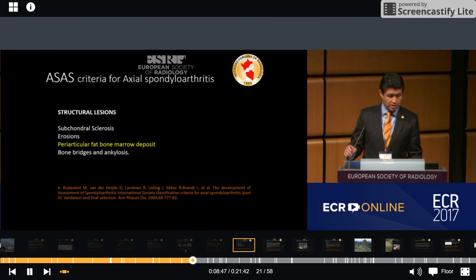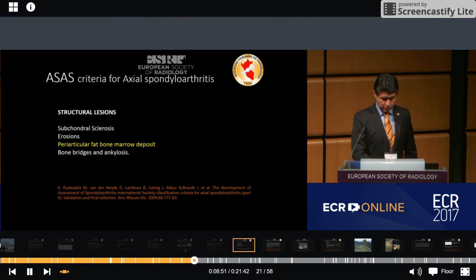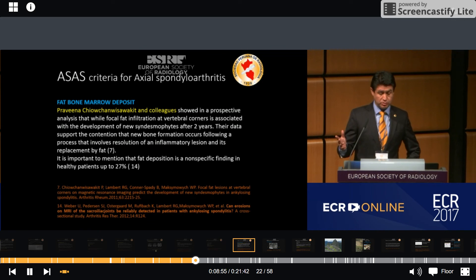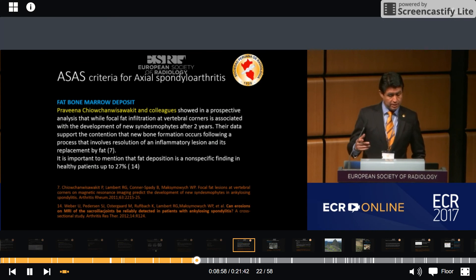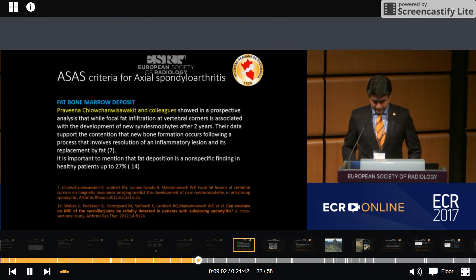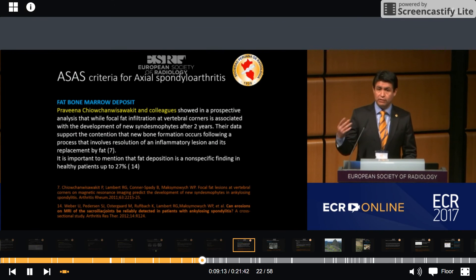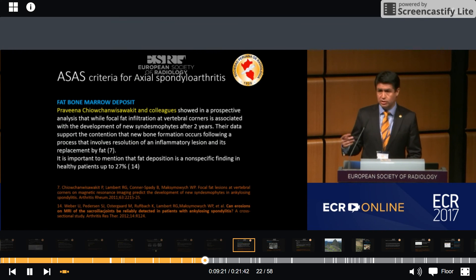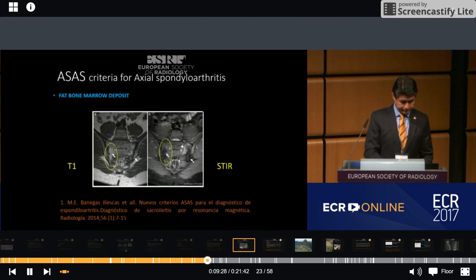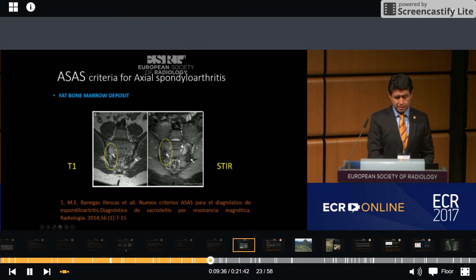Regarding structural lesions, the most important finding is periarticular fat bone marrow deposits. Research has demonstrated a sequence of steps including inflammation, fat bone deposits, and ultimately new bone formation. This sequence is important in the evaluation of SpA. Fat bone marrow deposits appear as hyperintense signal on T1 and hypointense signal on STIR. This finding indicates that structural damage has already occurred.